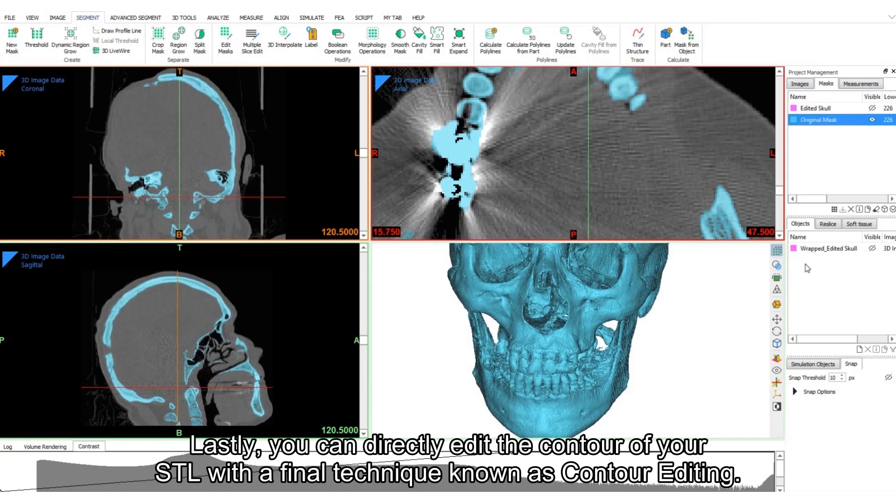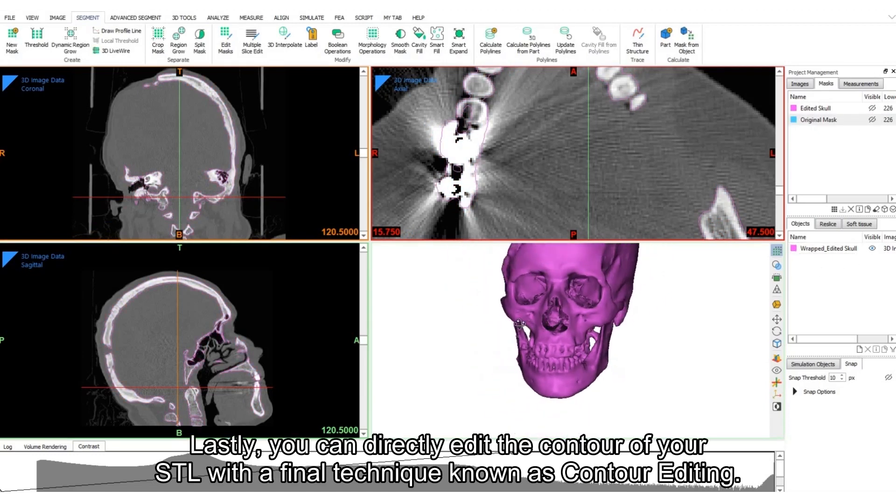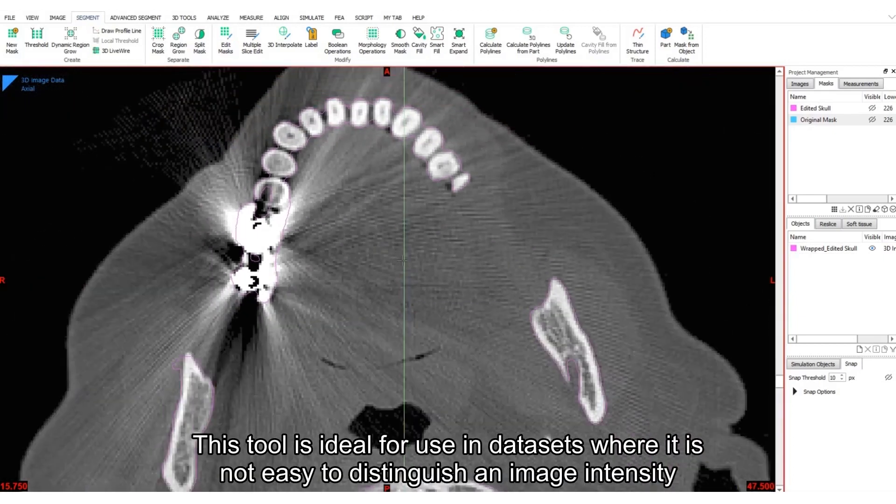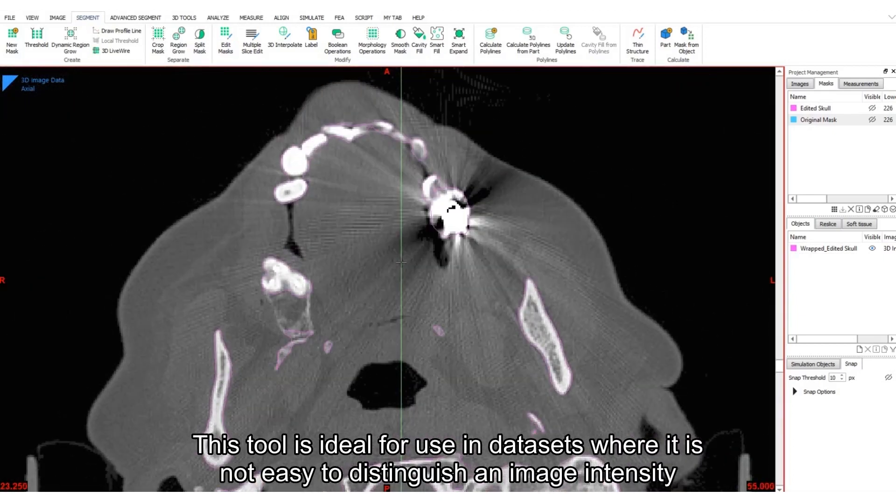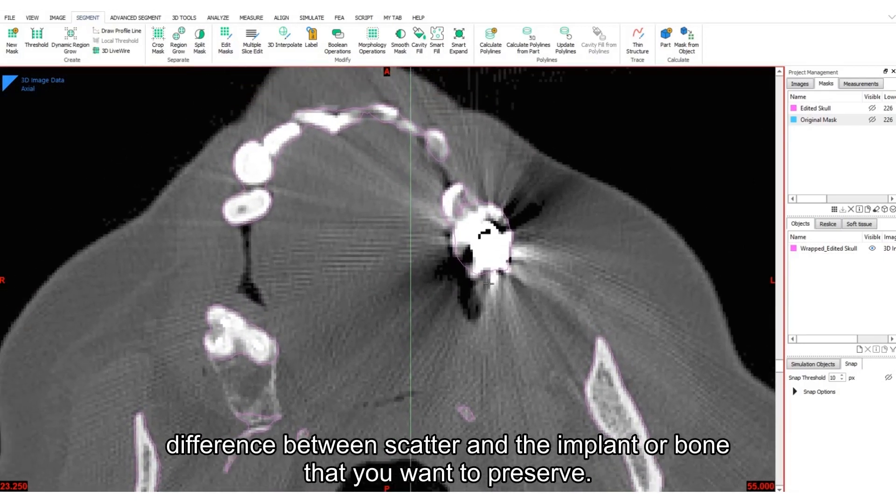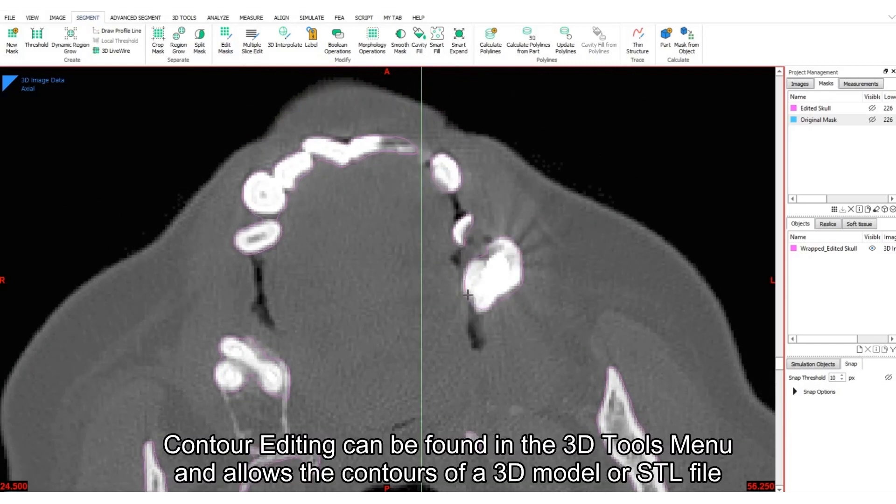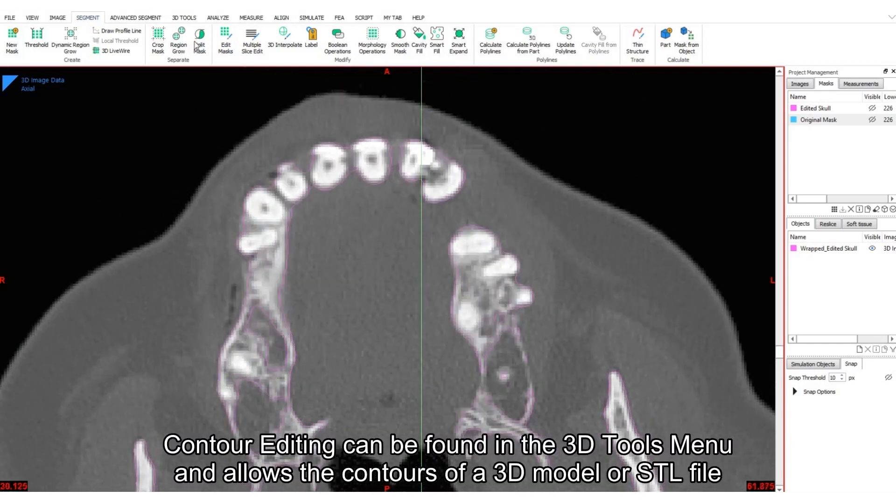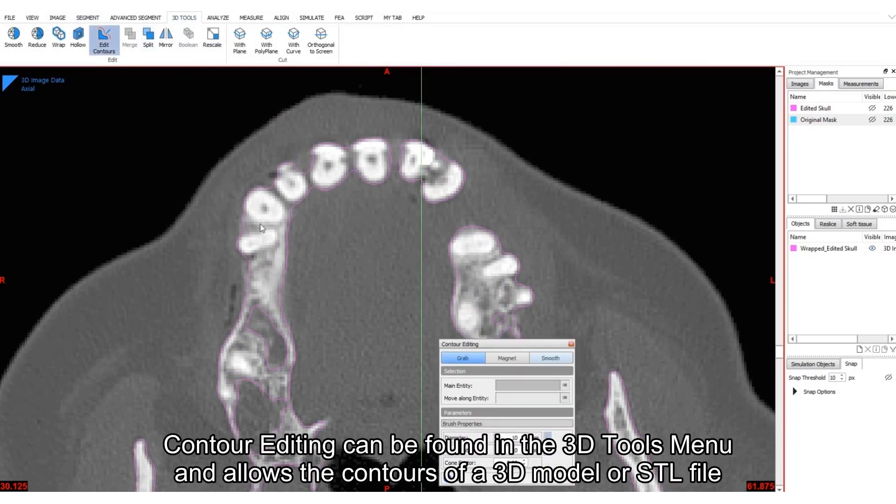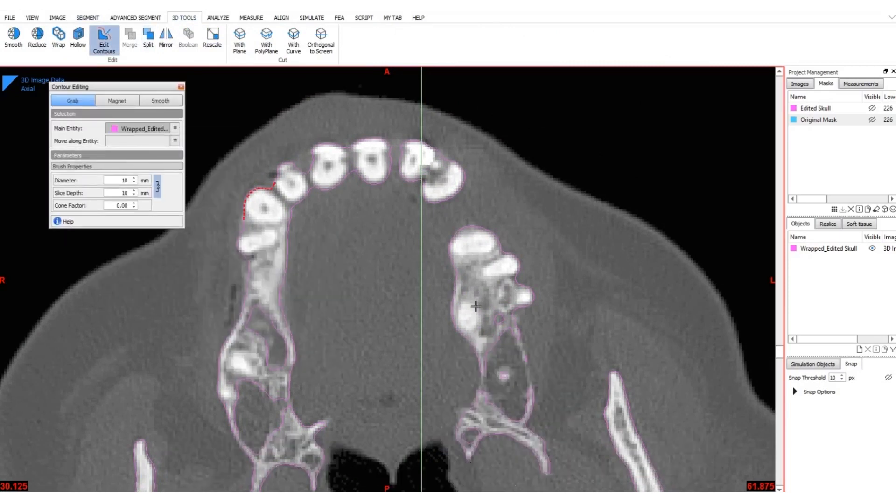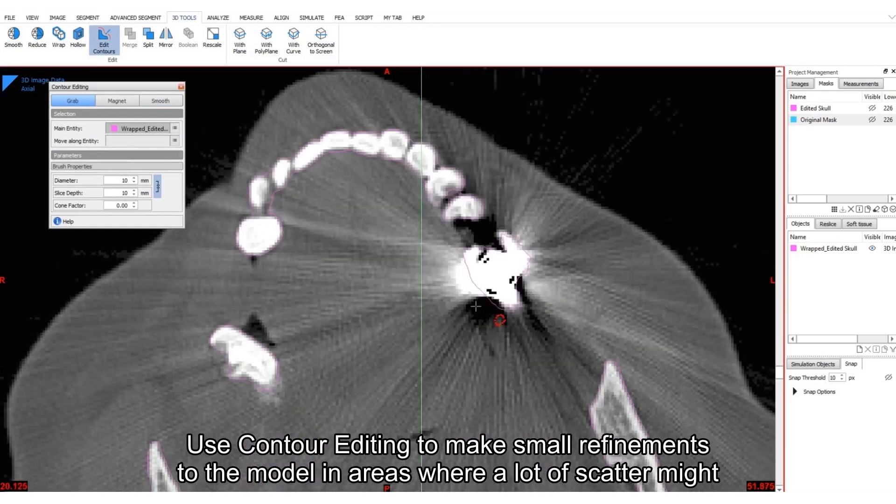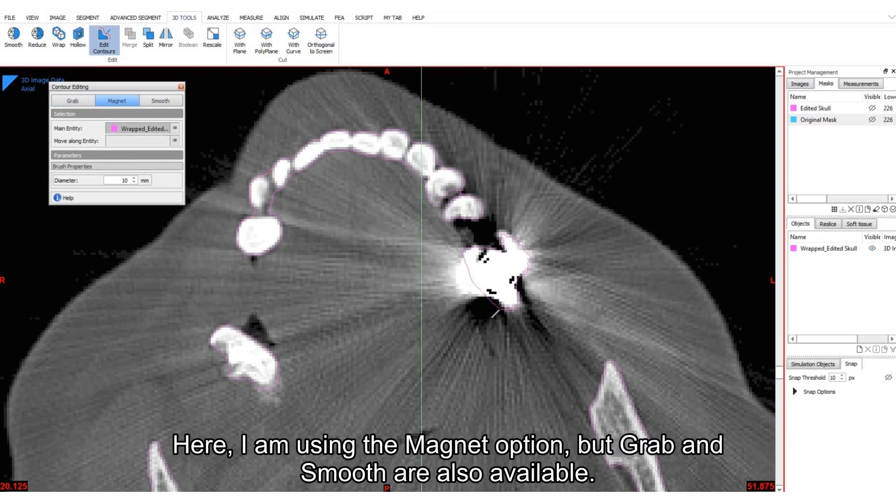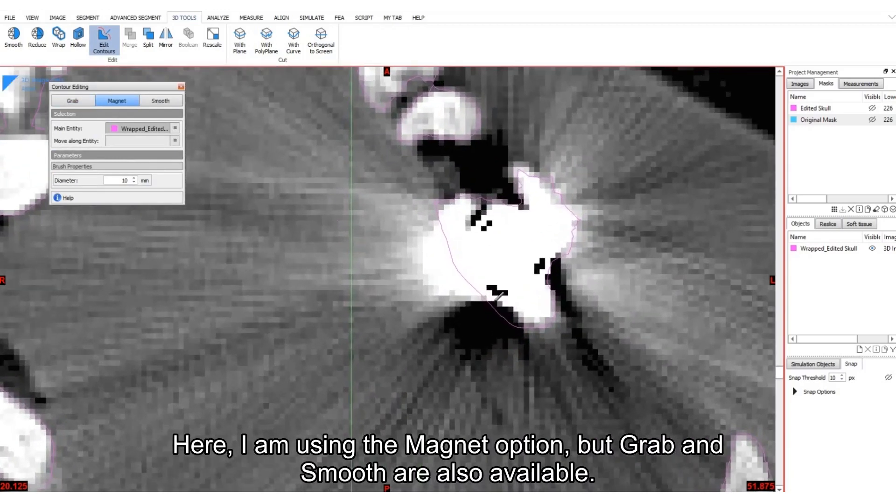Lastly, you can directly edit the contour of your STL with a final technique known as contour editing. This tool is ideal for use in datasets where it is not easy to distinguish an image intensity difference between scatter and the implant or bone that you want to preserve. Contour editing can be found in the 3D tools menu and allows the contours of a 3D model or STL file to be adjusted in real time. Use contour editing to make small refinements to the model in areas where a lot of scatter might have previously existed. Here, I am using the magnet option, but grab and smooth are also available.